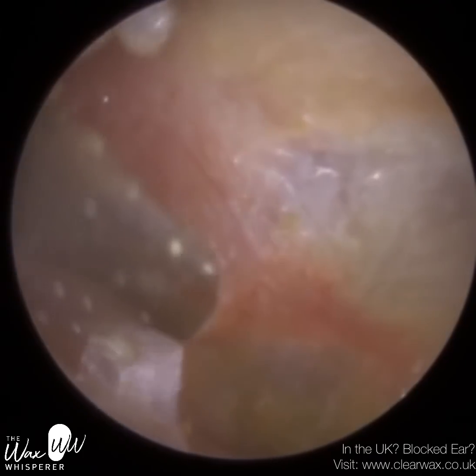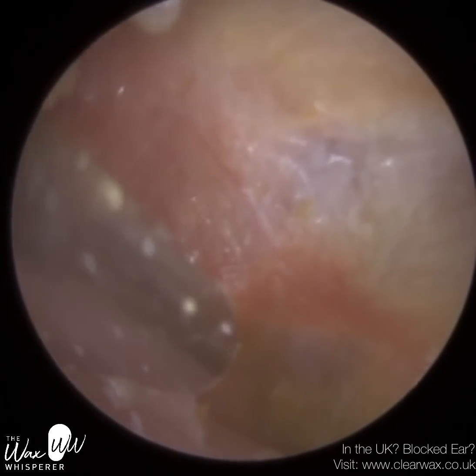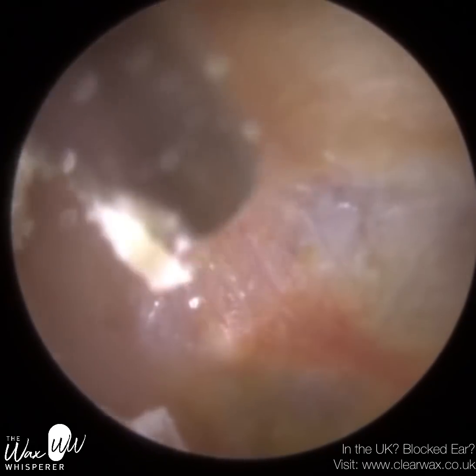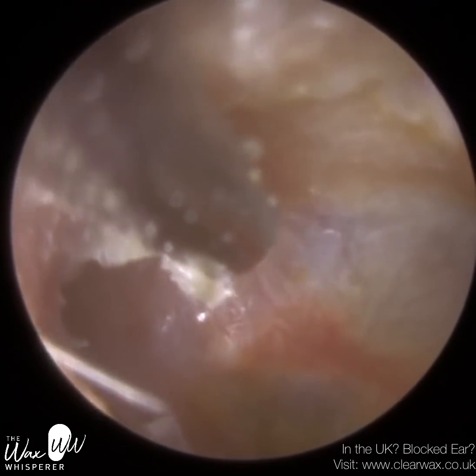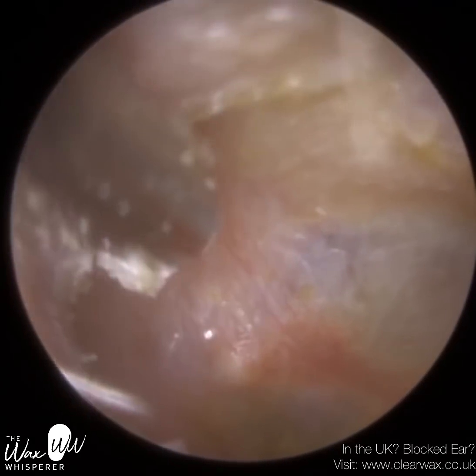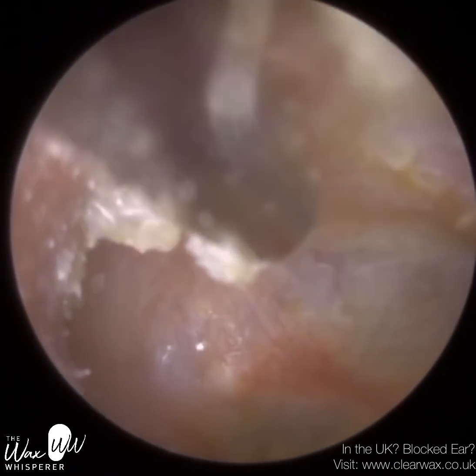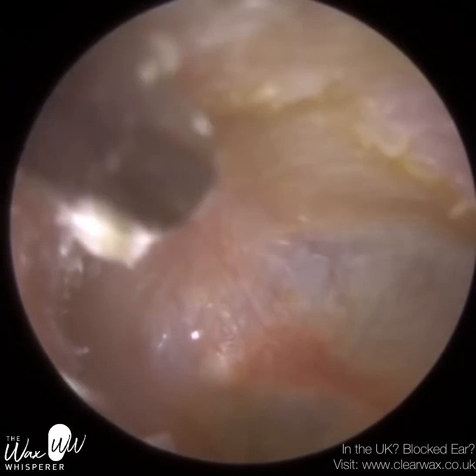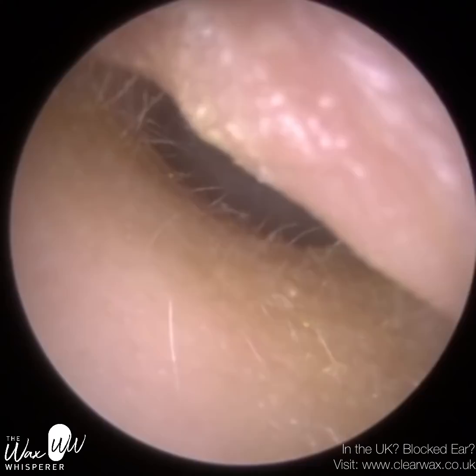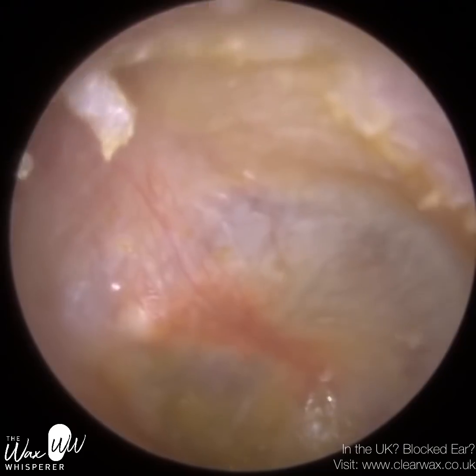We're nearly done. I think I'm going to stop the procedure after this little bit, and there's a bit at the top I think I'll go back for. I think I gave up on that skin on the left, on the front part of the ear canal. I peeled away the majority of it, but that last flap of skin just didn't want to come out and I didn't want to cause the patient any injury. So I'm going to the top part of the ear canal, so I got a bit out there. And now I'm just going to mop up near the entrance. Just a lovely, stunning view of the eardrum.